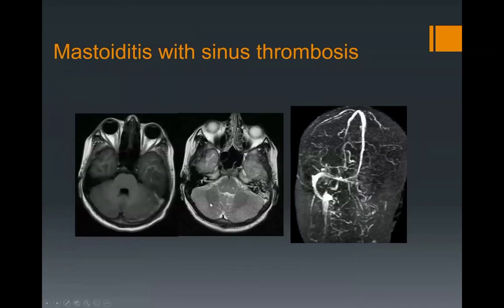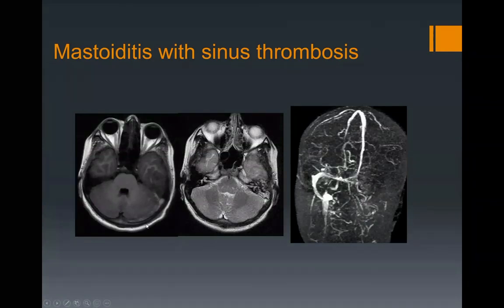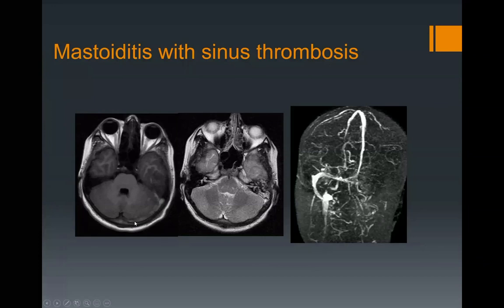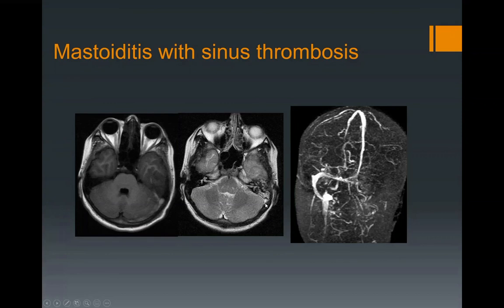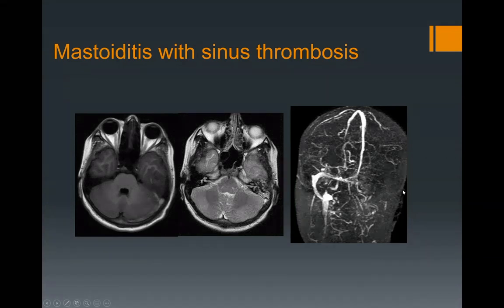Here's an example of mastoiditis with sinus thrombosis. If there's involvement of the sigmoid plate, you can have thrombosis of the sigmoid sinus. On T1 and T2-weighted images, you can see alteration of signal within the sigmoid and transverse sinus — bright on both T1 and T2, consistent with hematoma or clot on MR. An MR venogram confirms thrombosis of the transverse-sigmoid sinus and internal jugular vein on this side as a complication of mastoiditis.